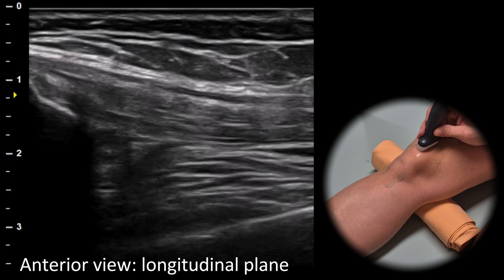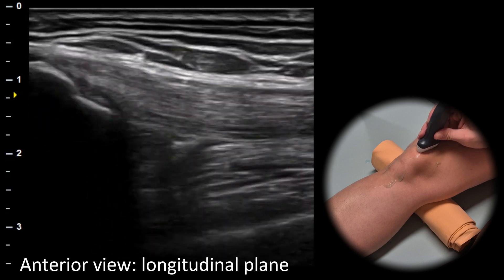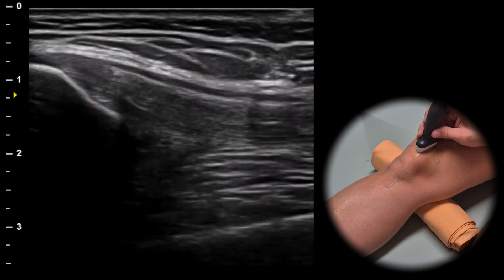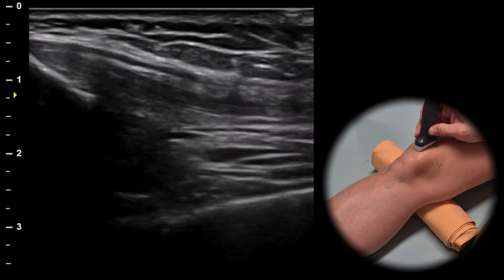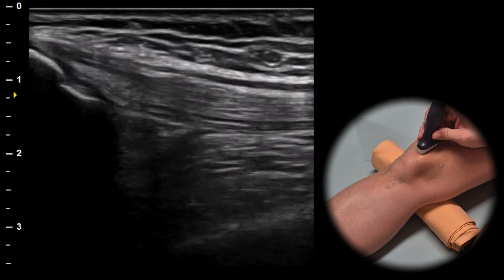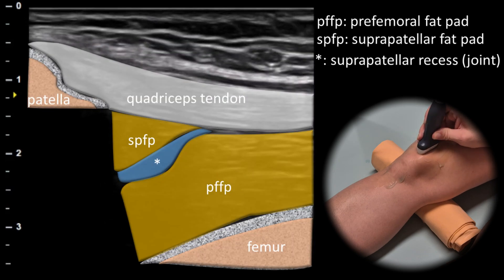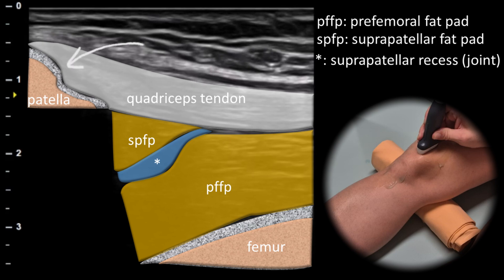In the longitudinal view we can assess the suprapatellar recess, which is the proximal part of the knee joint. Here we can scan for joint fluid. The suprapatellar recess is located between the prefemoral and suprapatellar fat pads. In this plane we can also evaluate the quadriceps tendon in its long axis and its attachment to the patella.